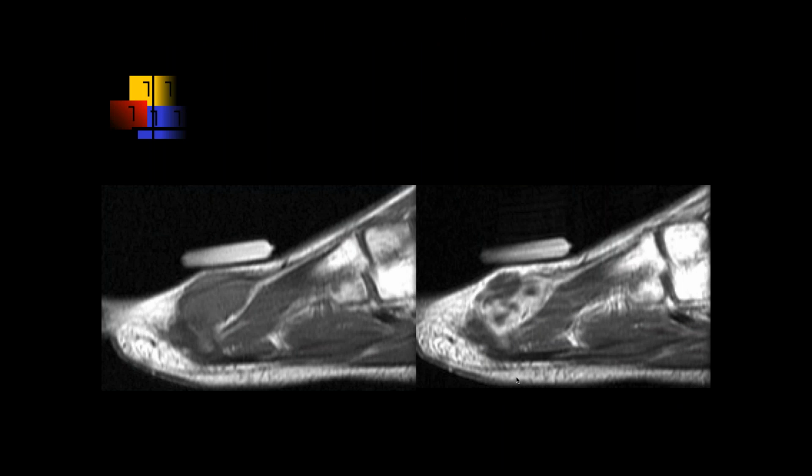Okay, Max? All right, so we got sagittal T1 pre- and post-contrast images demonstrating low signal intensity on T1 and then a post-contrast enhancing lesion in the dorsal distal aspect of the foot. It is extrinsic to the adjacent muscle, so again, could be some form of, I'm not sure what this would be. Maybe a lot of smudgy contrast enhancement. And is this connected also to a longitudinal structure here? Mm-hmm. Often smudgy enhancement is typical of schwannomas, so that's one thing you have to think about.